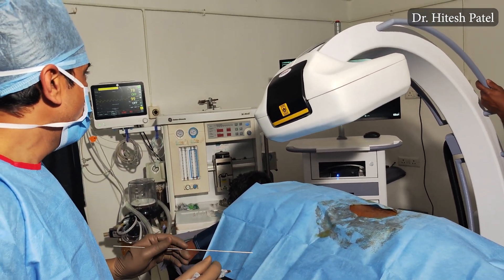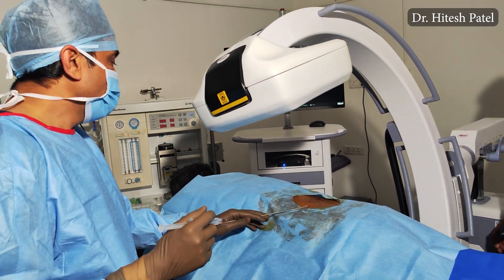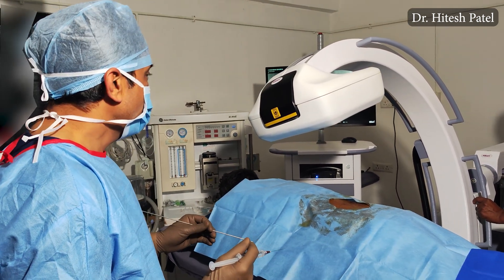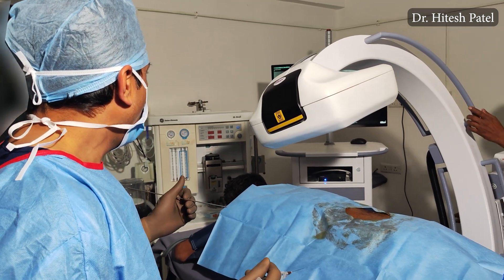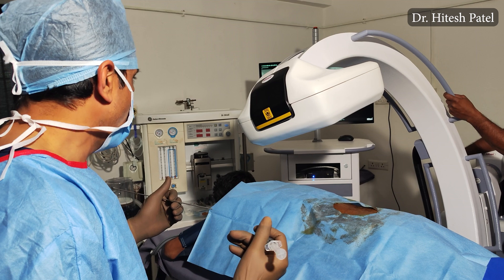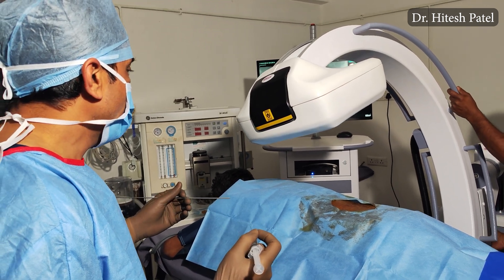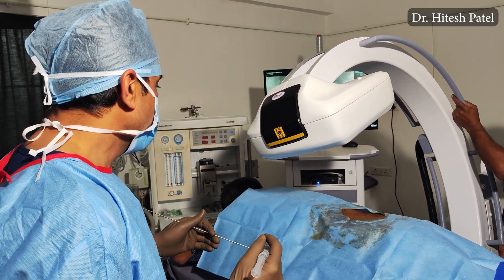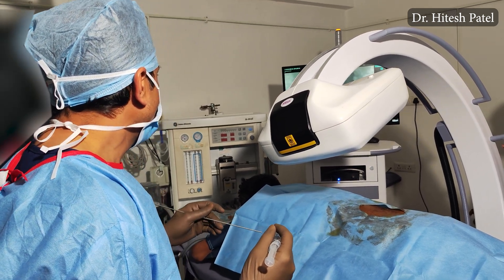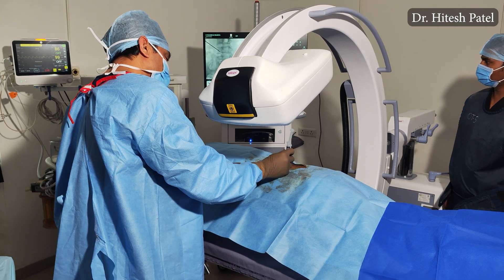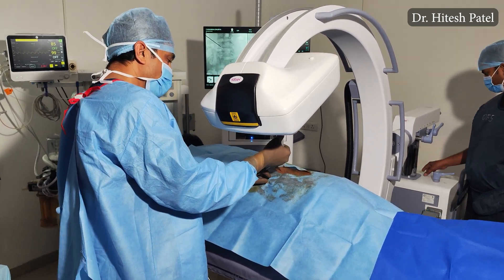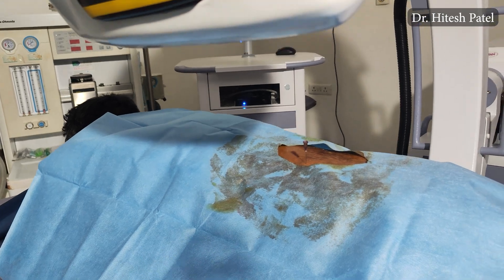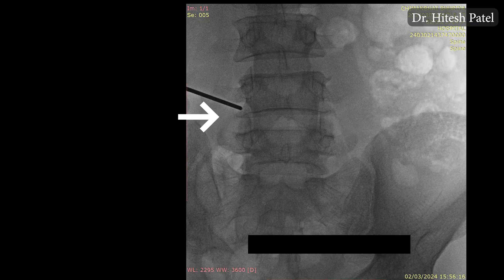We can see the same images on the C-arm view. Here we have opened the foramen. We still need a little more tilt towards the left side to open the foramen more. Once we have the squatty dog view, do minor adjustments if required before putting your marker and local anesthetic. Put your marker under the foramen at the 6 o'clock of the pedicle. Give the local anesthesia and wait for 30 seconds.